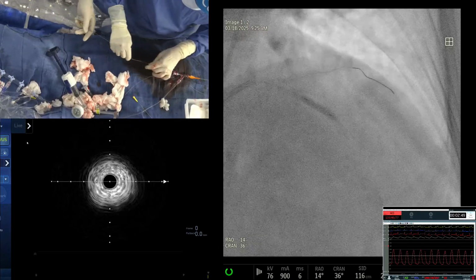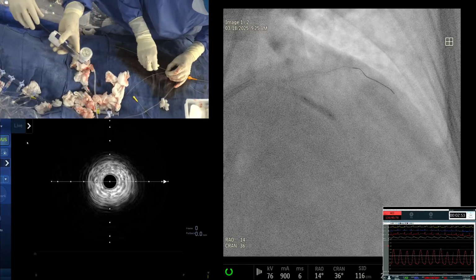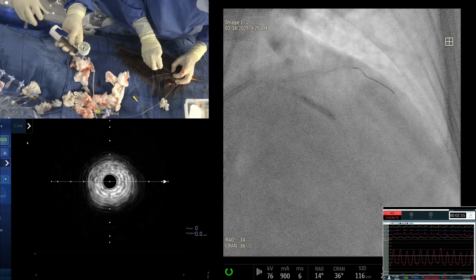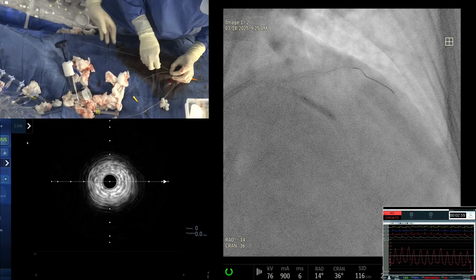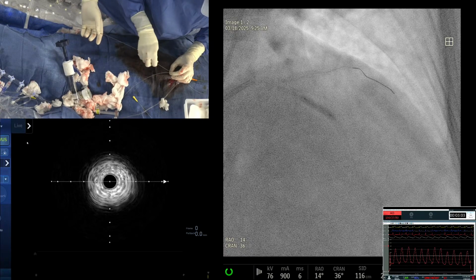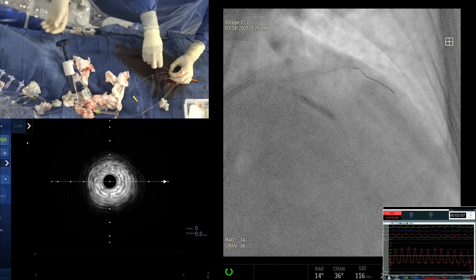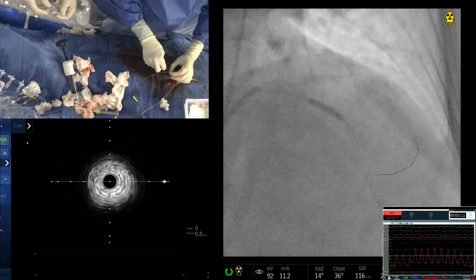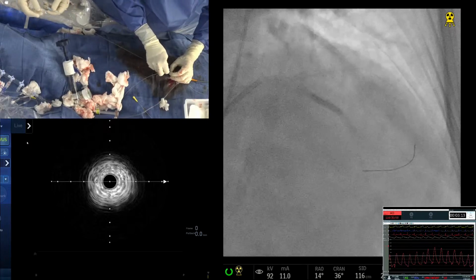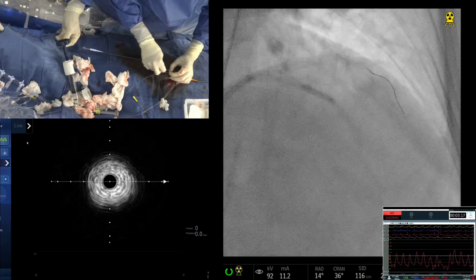Yes. So, Dr. I'm going to balloon a little, that's your answer to your question. So we did it. If you go to our app, that's what we say: first change the strut. Look, the questions are getting more and more people paying attention and following the cases. Okay, now we are ready for wire. Good. Yeah, I know. Good.